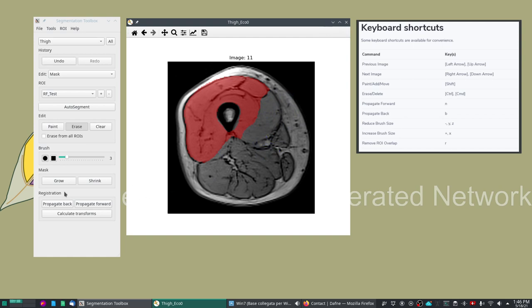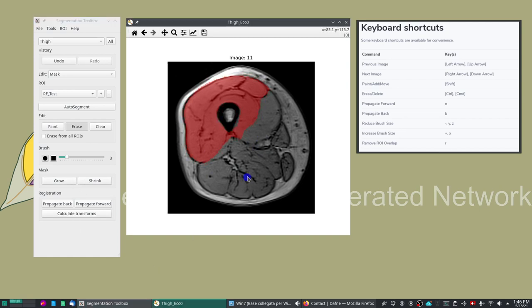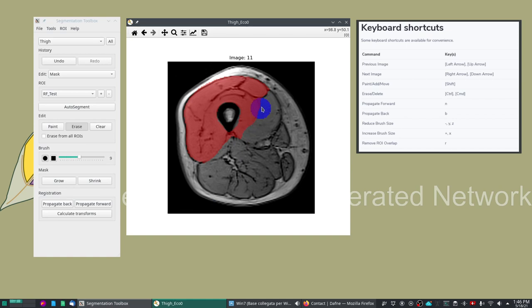Also some things that you can do in the mask mode: you can grow the mask and shrink the mask so that you can do some global adaptations.